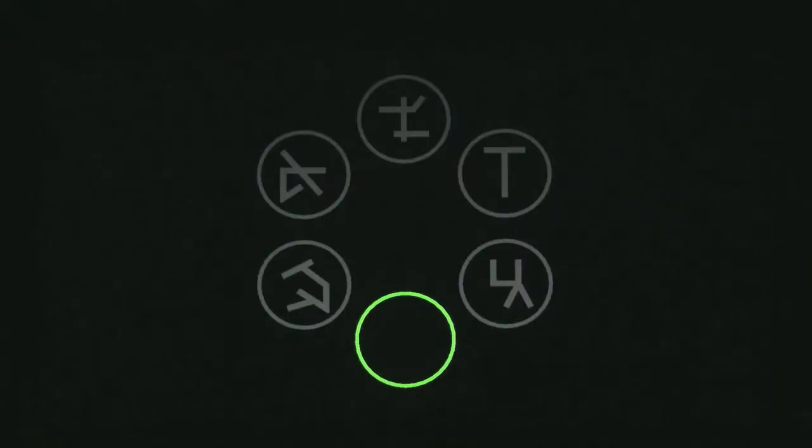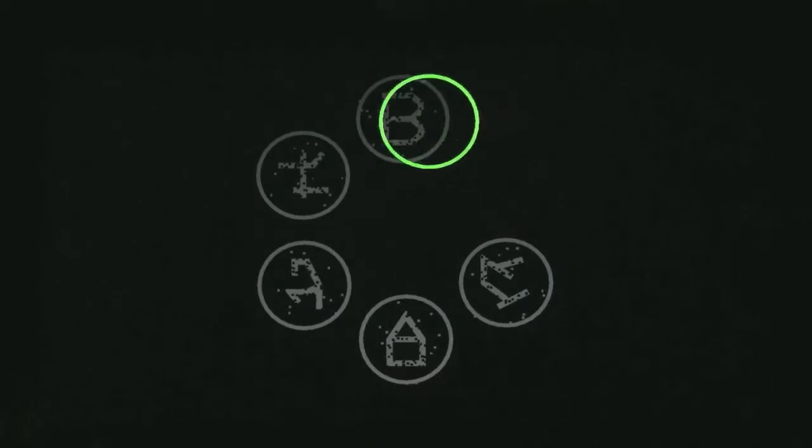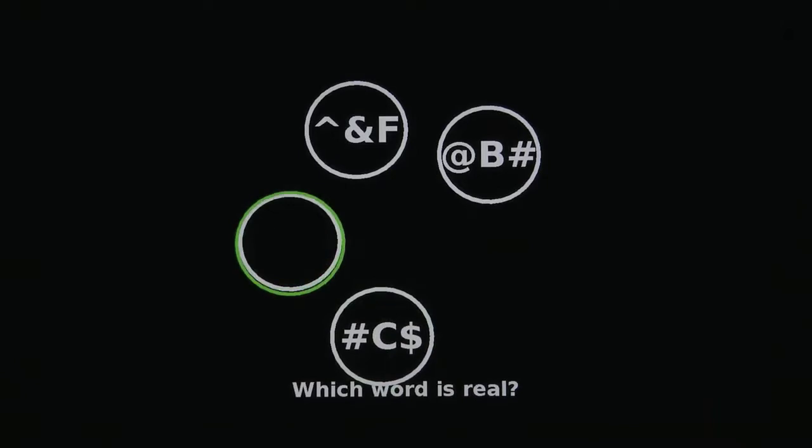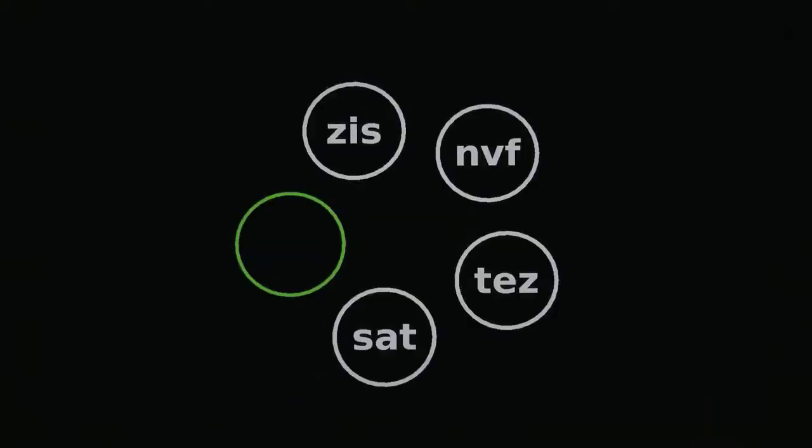The letter discrimination test requires the patient to find the real letter among non-letter symbols. The difficulty of the test increases when the patient moves to the correct answer and decreases if they do not. Each test begins with 3 instructional trials, which allows the patient to transition from test to test efficiently and effectively.